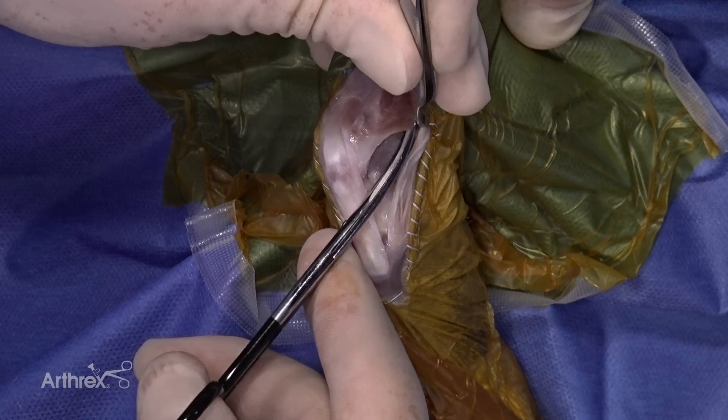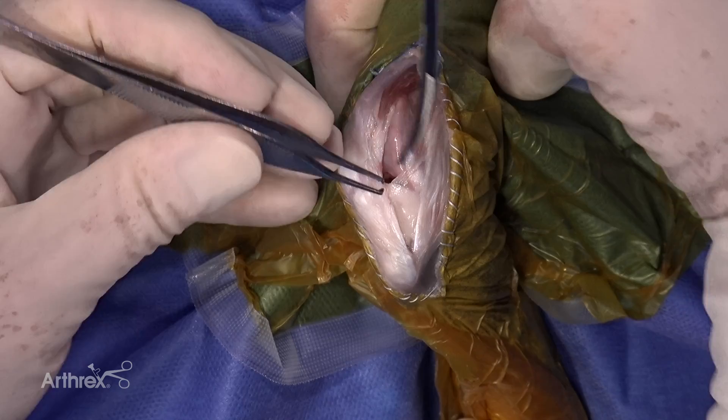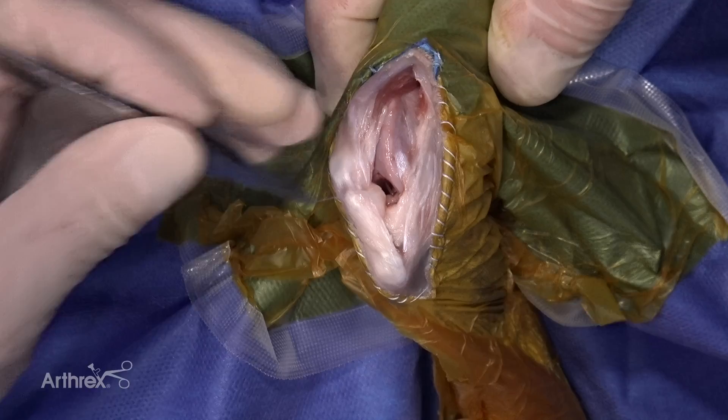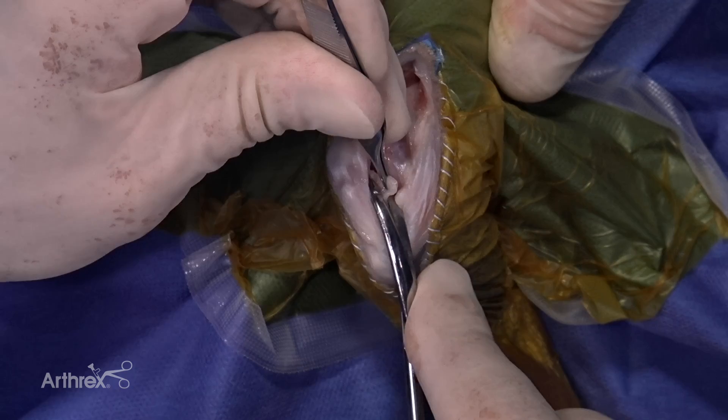That will allow us to reflect the patella. I'll bring that distally just a little bit and you can see the fat pad there. You can take a section of that fat pad out if you need to see inside the joint better — so that's what I'm going to do right here, just excise a little bit of that fat pad.